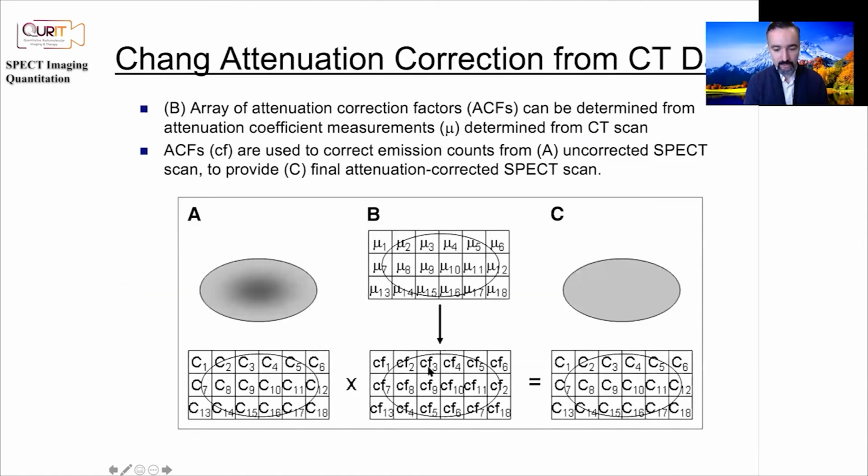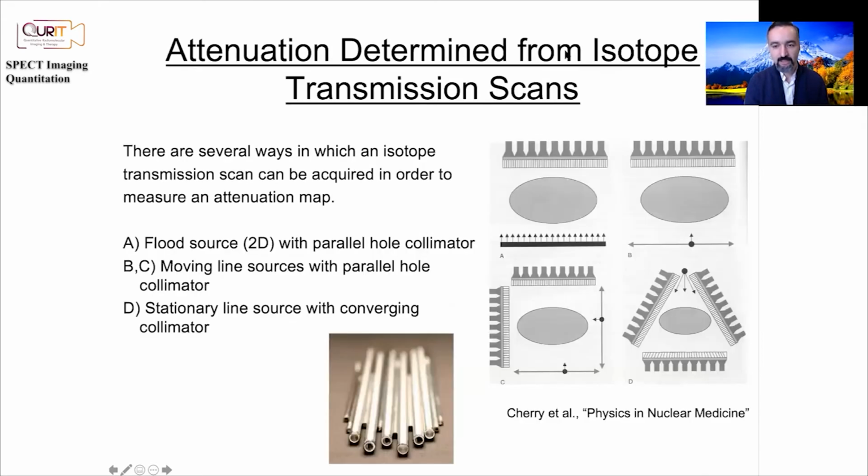Okay, so back to here. Now you get these better correction factors, attenuation correction factors, ACFs, and now you get an image that presumably looks better.